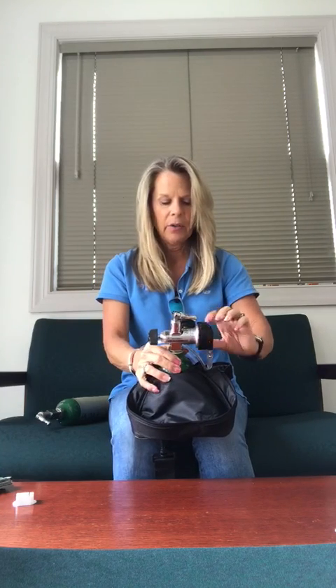All you have to do is crank it open by turning it a half a turn, and make sure the setting on the regulator is in the off position so you don't drain the pressure, and you're ready to go.